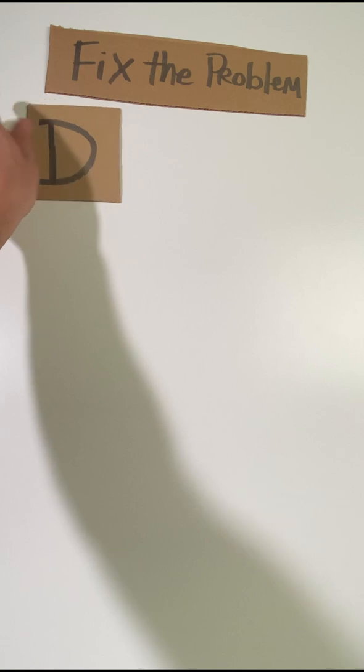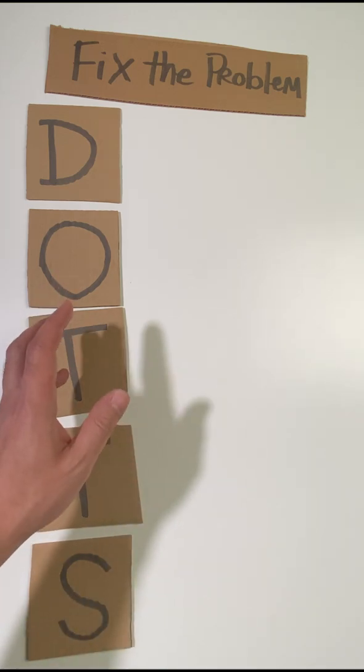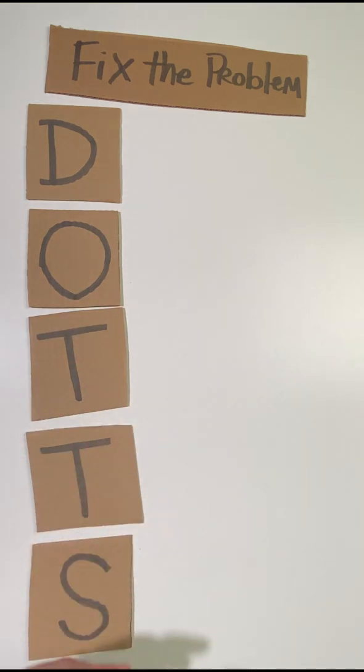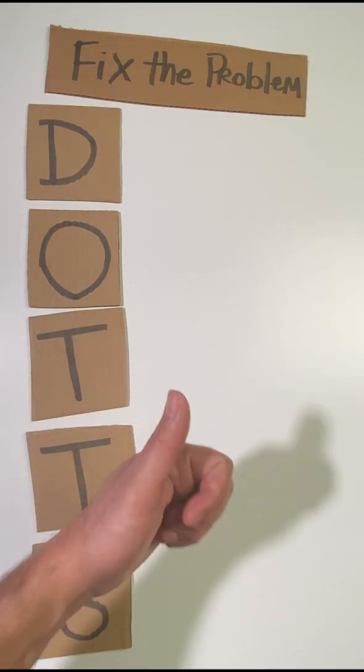Once you've gone through the differential of what the cause of the problems can be, it's time to go through and fix the problem. And for that we're going to use the mnemonic DOTS. Now it's very important, even if you figure out what the problem is on one of the initial steps, go through to the end of the algorithm. This is going to be a really good check on your system to make sure everything is A-okay.